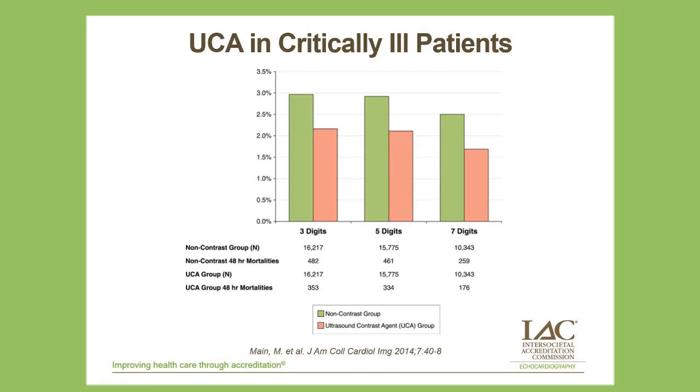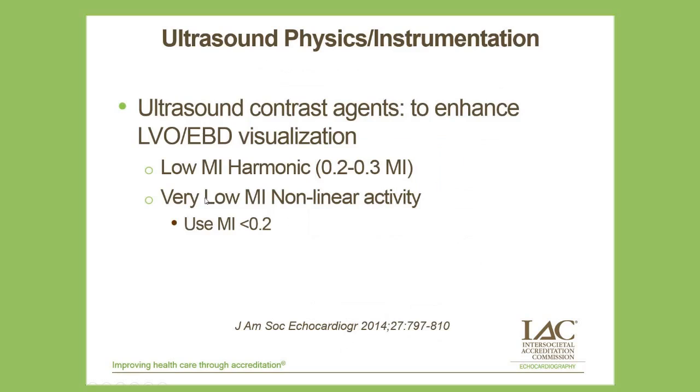You can see that adding contrast in that first 48 hours was associated with a significantly reduced mortality in this patient population. In fact, a 28% reduction in mortality was observed, and I don't think it's because contrast was therapeutic in any way in this setting, but I think, as Mike pointed out, getting the diagnosis early with contrast is critical to improving patient care, and I think this is pointed out both in the CURT study as well as in this study.